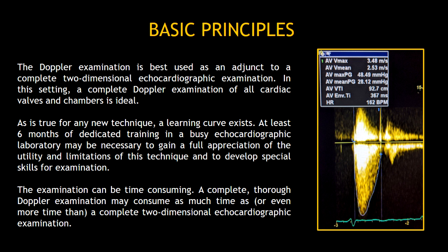The Doppler examination is best used as an adjunct to a complete two-dimensional echocardiographic examination. In this setting, a complete Doppler examination of all cardiac valves and chambers is ideal. As is true for any new technique, a learning curve exists.